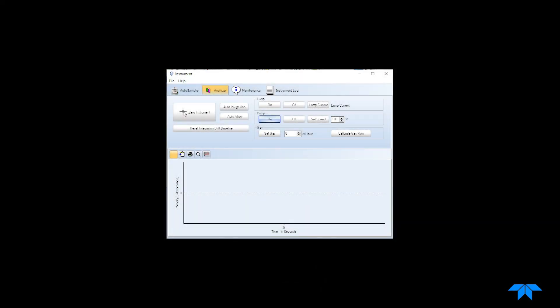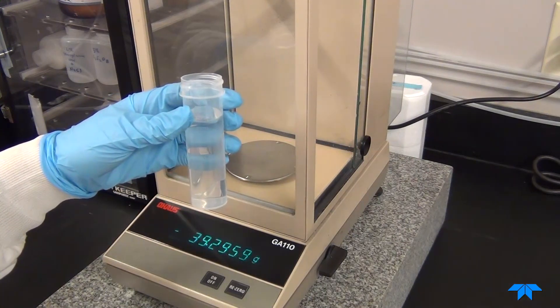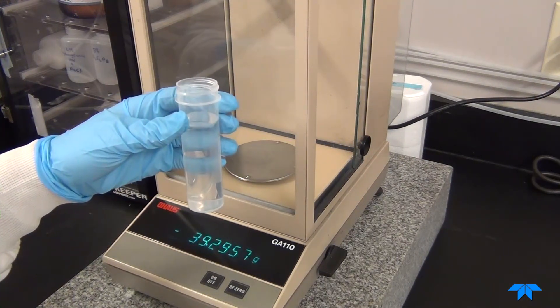In the instrument controls tab of the QuickTrace software, set the analyzer pump speed to one hundred percent. Now we are ready to begin.